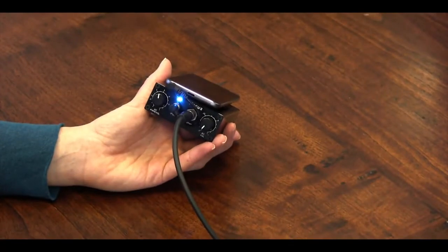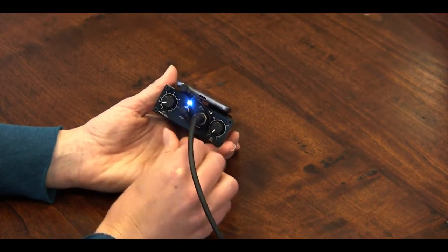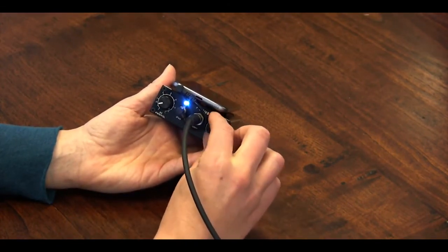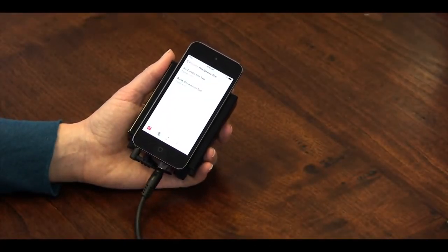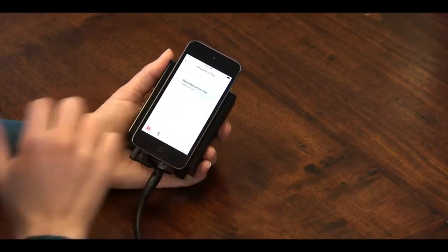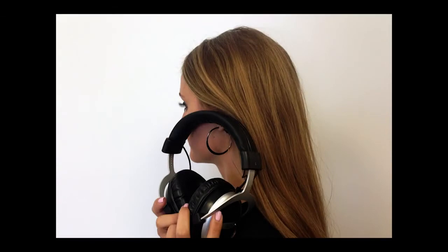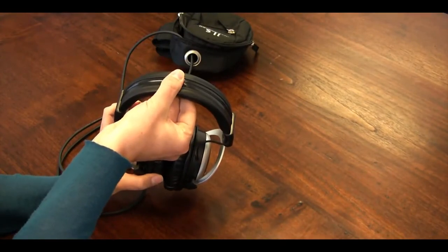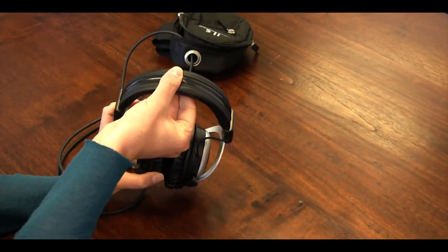To test the bone conductor, turn your air conduction volume as low as it will go without turning the amplifier off. Turn your bone conductor volume clockwise to 1. Go back to the headphone test playlist, select bone conduction test, and then select the BC test track. Hold the headband close to your ear to hear the music through the bone conductor. You may also pinch the bone conductor between your fingers — you should be able to feel it vibrating slightly. You have now confirmed that the headphones are fully functioning.